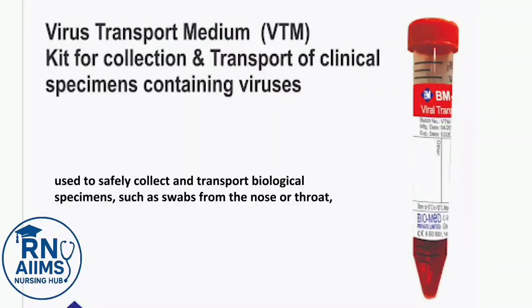VTM tube. Viral transport medium tube. Small blue diamond. It is a specially designed tube used for collection, transport, and storage of clinical specimens that may contain viruses like COVID-19, influenza, etc., before laboratory testing.